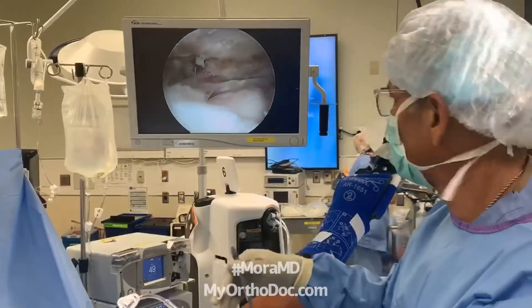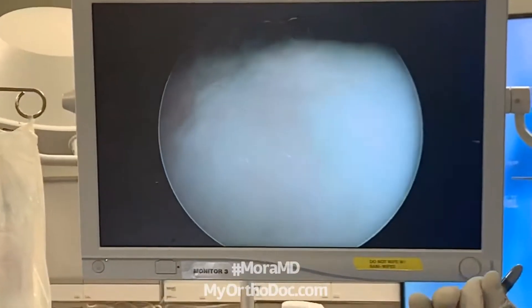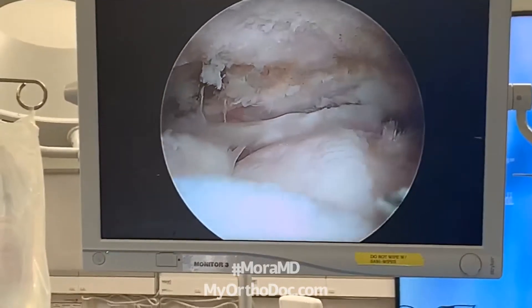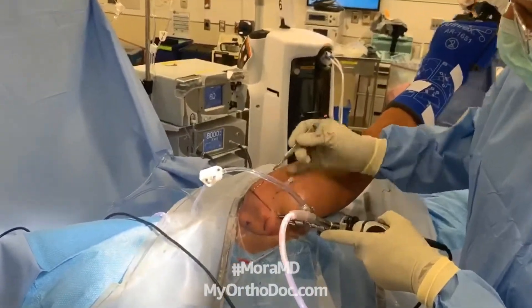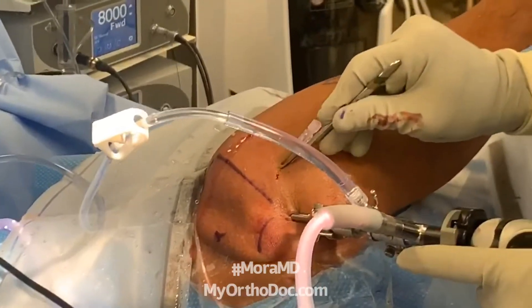What I'm noticing over here is that a lot of the tendon actually fell posteriorly, which means I'm going to be pulling it anteriorly. So if I want to pull it anteriorly, I'm going to have to create a cannula on the front, and I'm going to create another viewing portal.